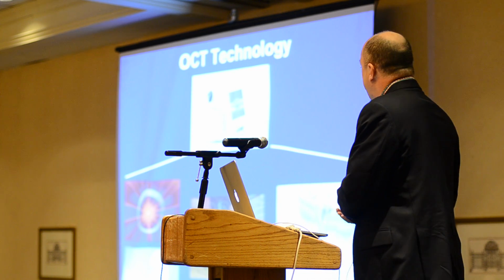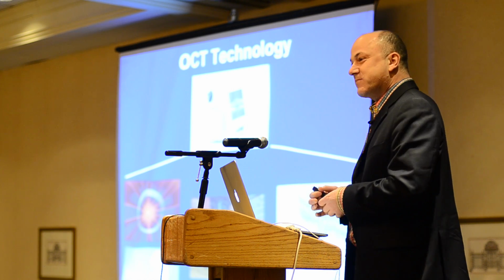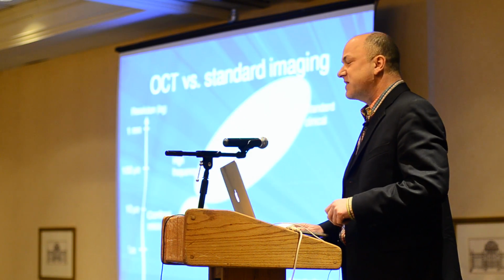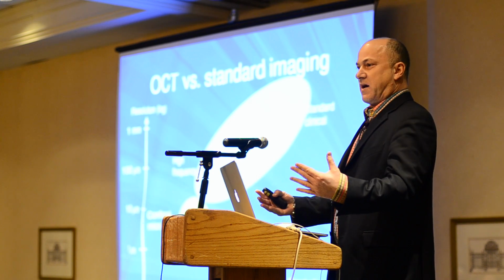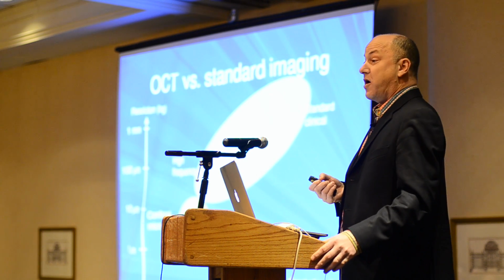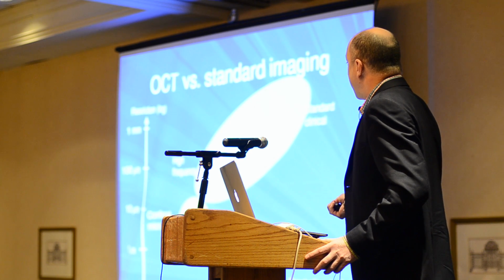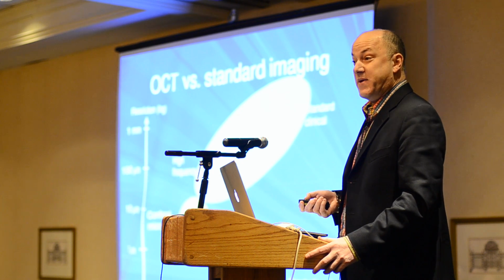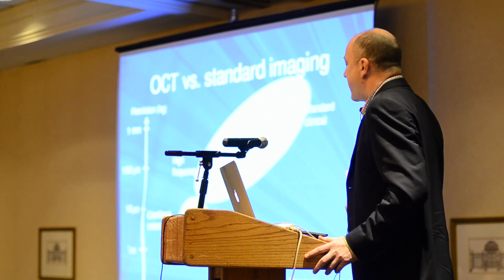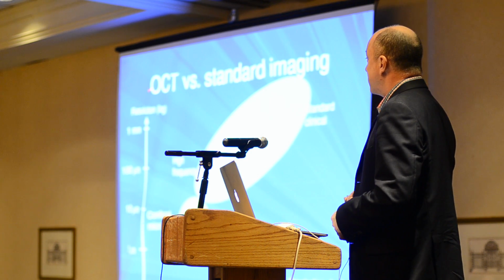So basically, if you can think about it in these three simple steps, you have the idea of the high technology of OCT. Why we use OCT rather than other instruments is this. When we want to image something, our resolution, how sharp a picture we can get, is dependent on the wavelength of the light. And when we use larger wavelengths, such as ultrasounds that we use in many medical procedures, that larger wavelength can give us a better penetration into tissues. We can image deeper down, but the resolution of the image is limited.